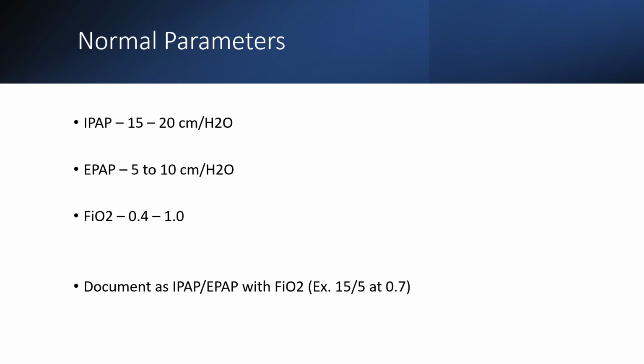So when I'm programming the BiPAP and I'm setting it up, these are the parameters I use. There's a little bit of a debate, and I've talked to some people, and everybody's got a bit of a difference of opinion. I have used BiPAP with quite a few people with great success, so I promise if you're a novice, this is the way you want to go, especially if you're working in the pre-hospital environment, especially if we're talking about that acute initial therapy, right?